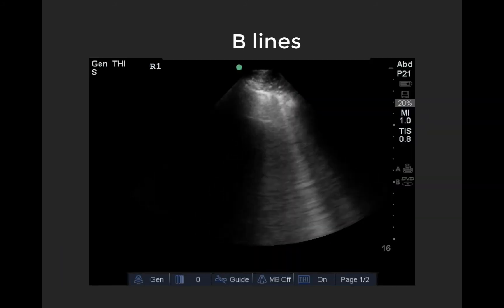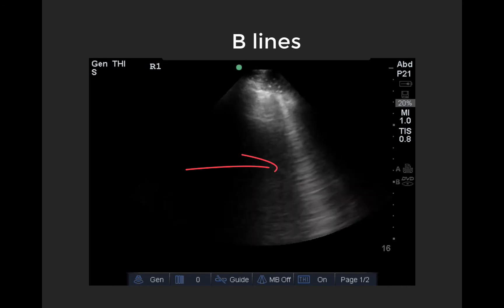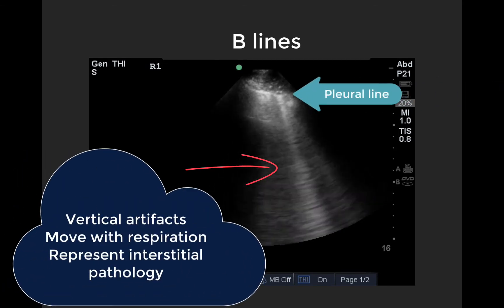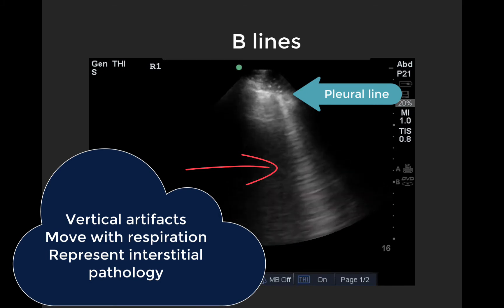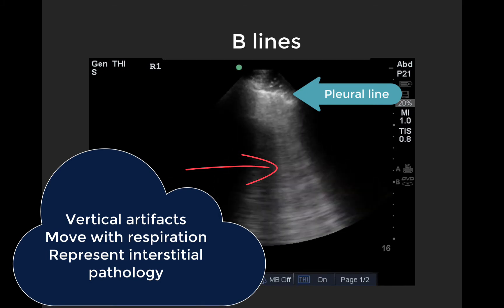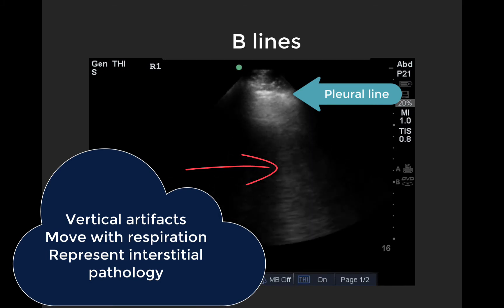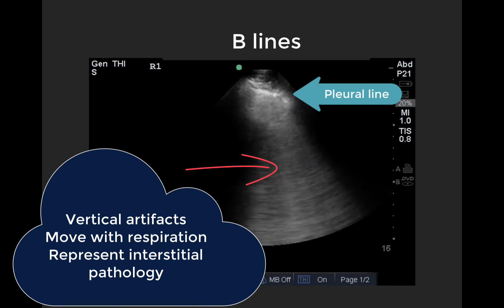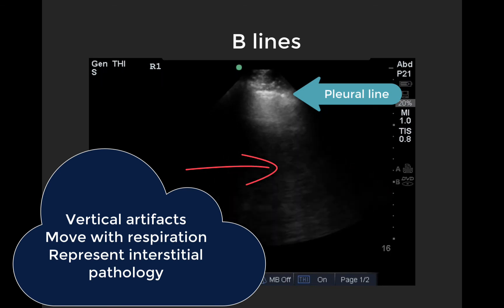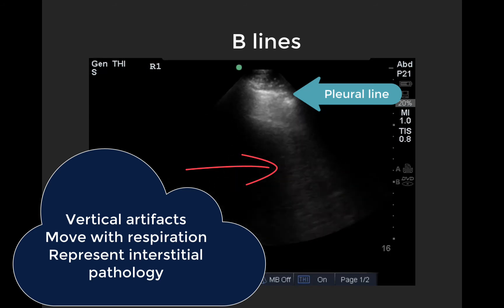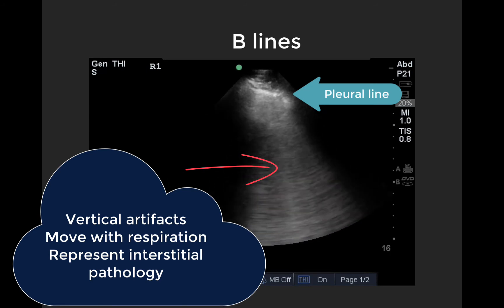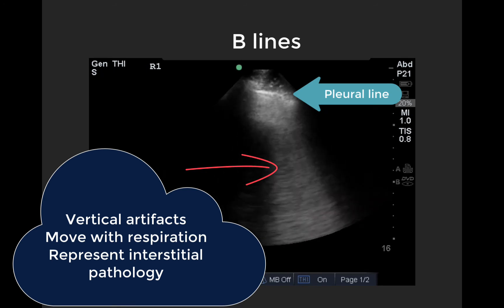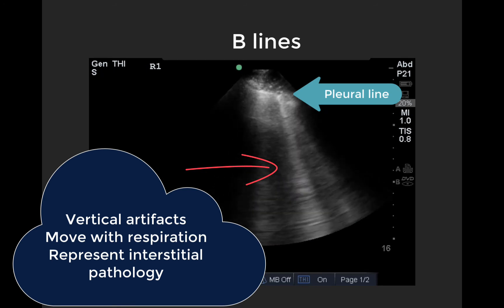B-lines, in contrast, are vertical artifacts emanating from the pleura, and they're seen in interstitial syndromes — commonly pulmonary edema where there is cardiogenic transudate, aka water, filling the interstitium, but also other things that can fill the interstitial space, such as pus in earlier atypical pneumonia, fibrosis in interstitial lung disease, blood in diffuse alveolar hemorrhage, etc. B-lines should travel all the way down the screen, move with respiration, and obliterate A-lines.